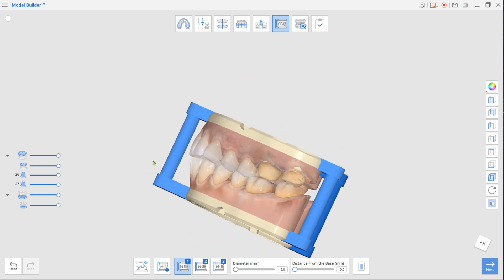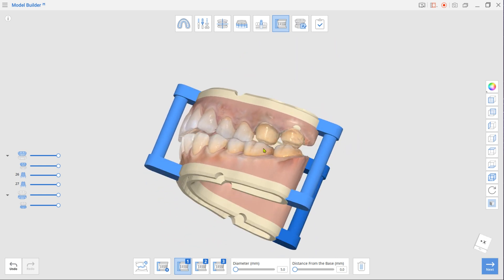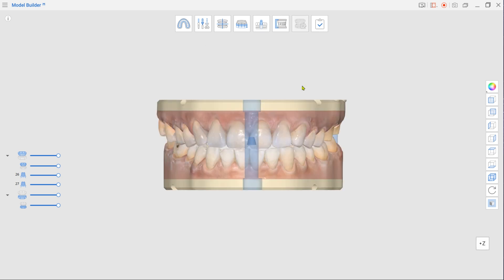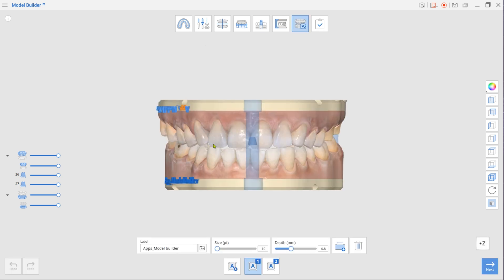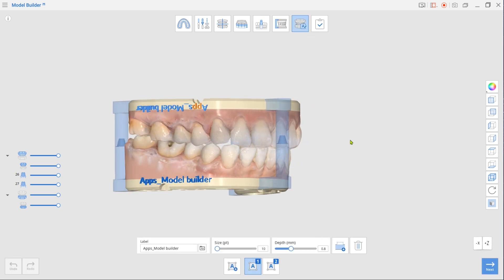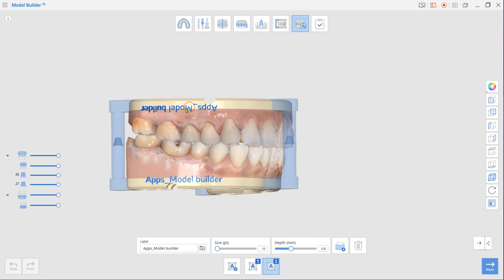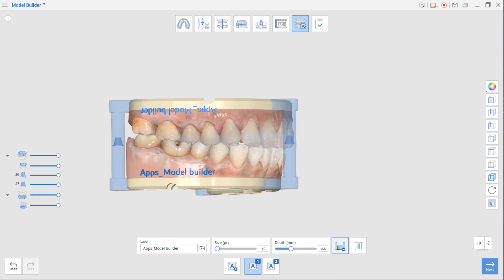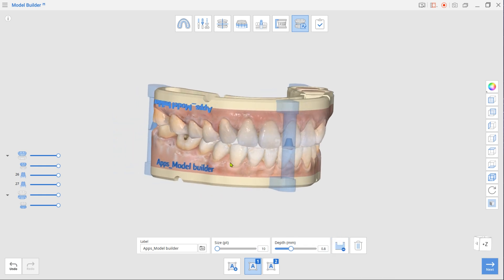Once done, move to the final Labeling mode. The first label is automatically created using the case name. Drag the label to change its placement on the base. You can choose to engrave or emboss the label. To change label text, enter a new name in the label box below.